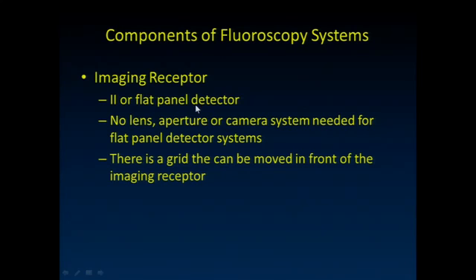So I'm going to ask the same question I asked yesterday. How many people still utilize some fluoro systems with an image intensifier instead of a flat panel detector? So there's a couple people. They are still out there. A few years from now, I think for me to talk about image intensifiers isn't going to make a whole lot of sense because they're being replaced fairly quickly.